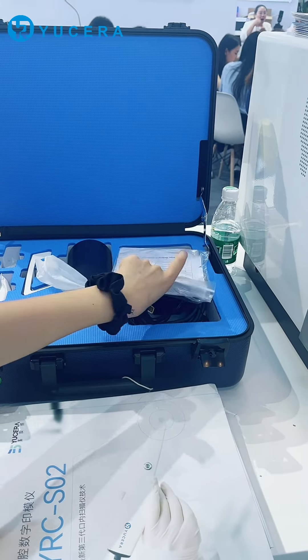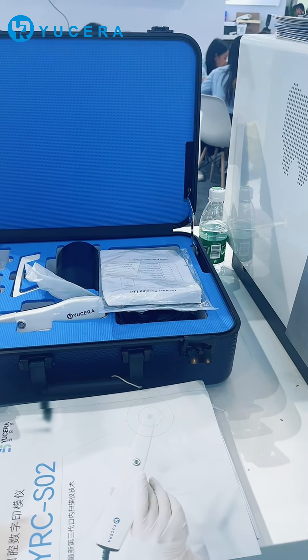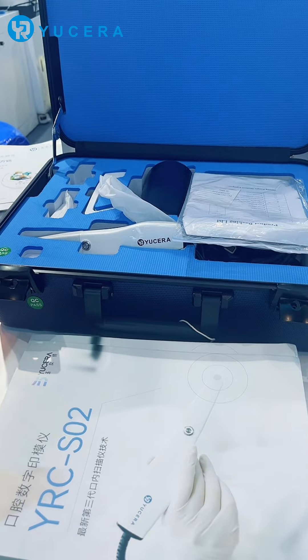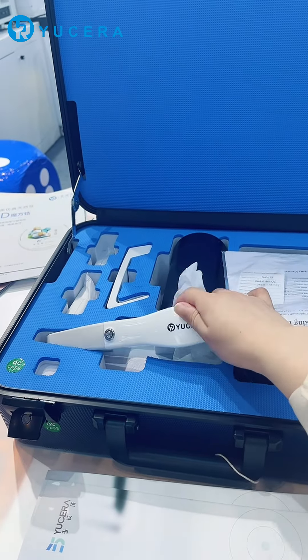First of all, a very important point is the accuracy, which is 10 microns. This will make the scan file as similar as possible to the patient's mouth, so that the teeth we designed will match better and will be more beautiful.